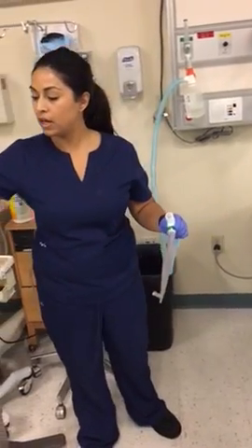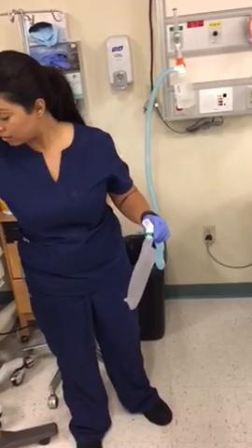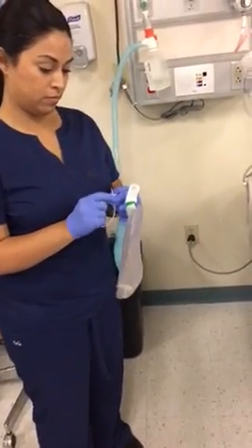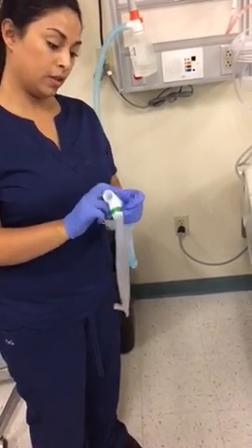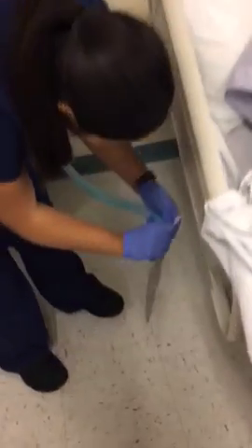Actually, I want to attach the bag first, that way. Okay, now it's ready, and I'm going to go ahead and attach it here.